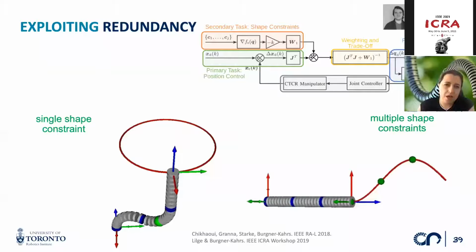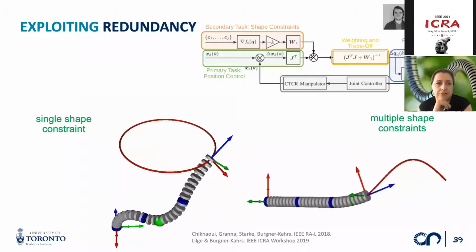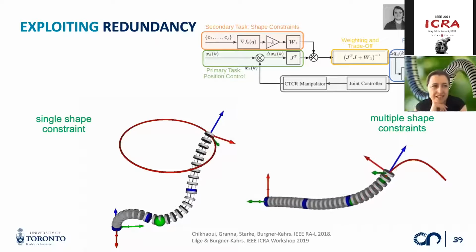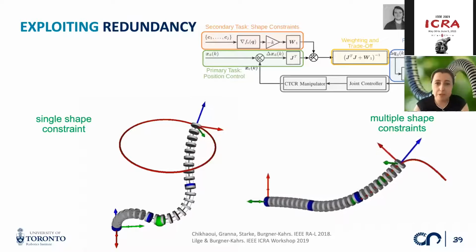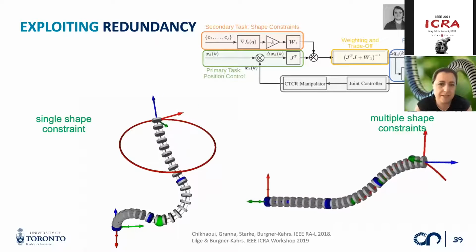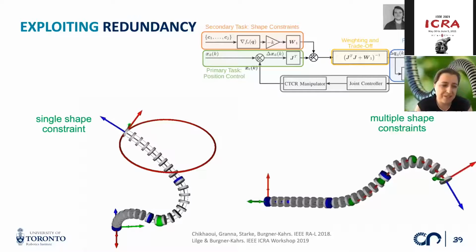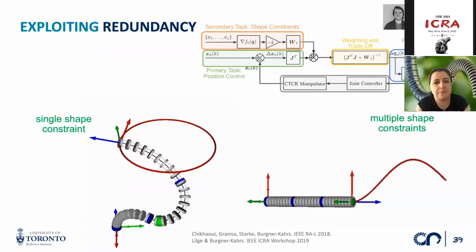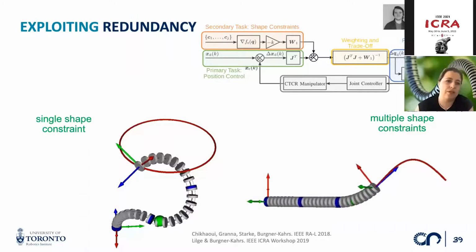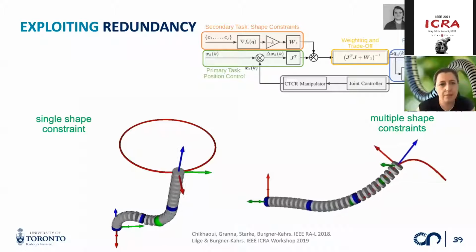And I just want to give one example of underexploited areas on the control side of things, and that is redundancy. We can see on that slide some of our attempts and work on adapting null space projection methods and weighted damped least squares approaches to achieve secondary tasks by resolving the redundancy in the system. We see this 3-segment tendon-driven continuum robot with the extensible sections that I've been showing earlier, performing a position-controlled task. On the left, we see it circling a path, and here we see it deploy along a path.